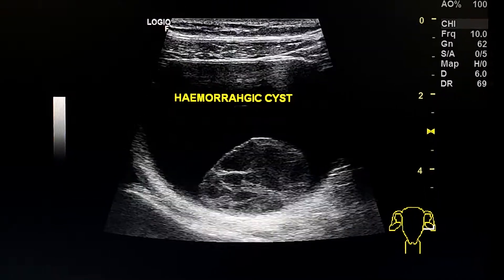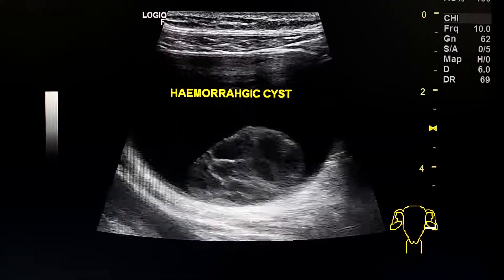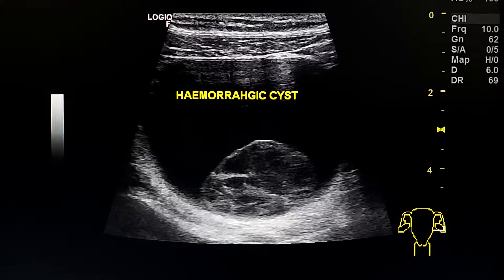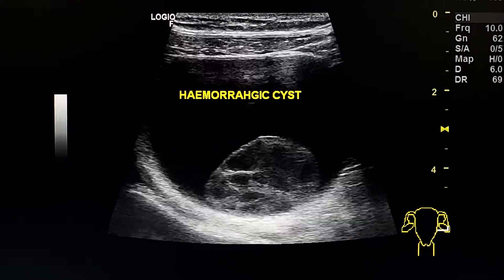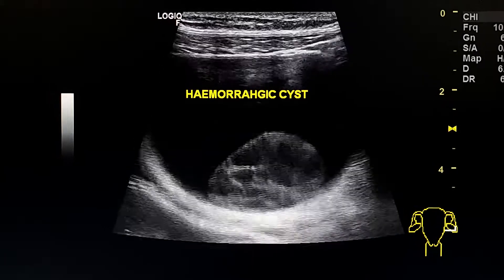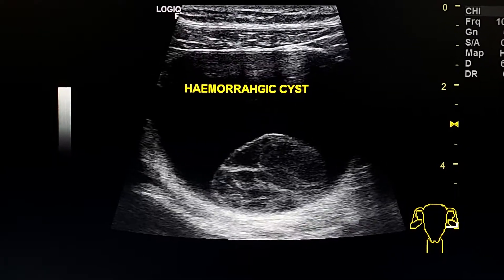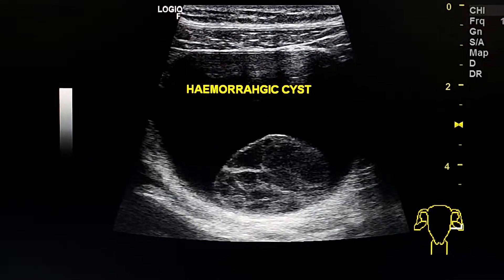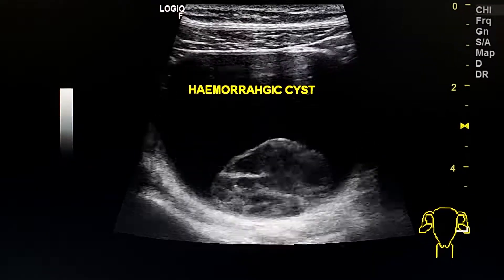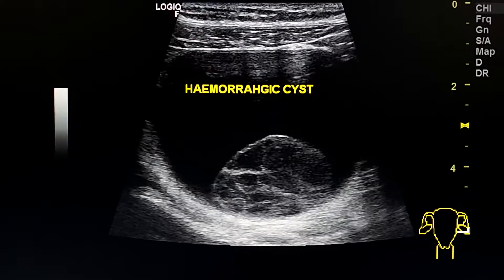This is an ultrasound exam of a young female with left pelvic pain. Here we see a hemorrhagic cyst — a classic appearance. We see a thin-walled cystic lesion with internal clot. The clot is oval-shaped and adherent to the dependent wall. We see slight movement of this clot by pushing on the cyst.